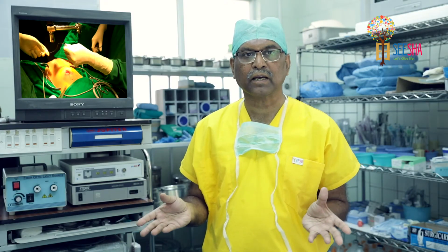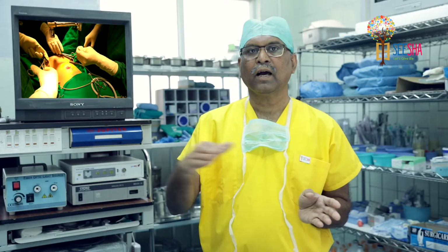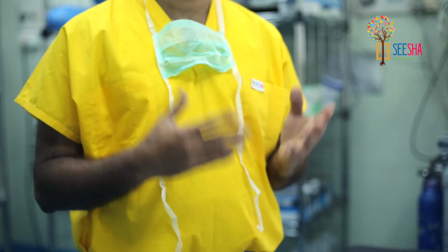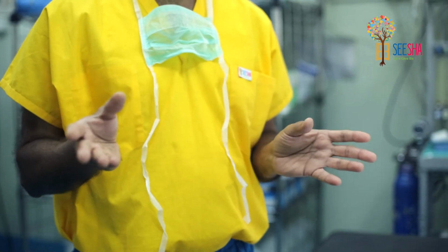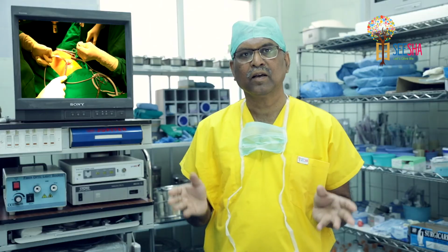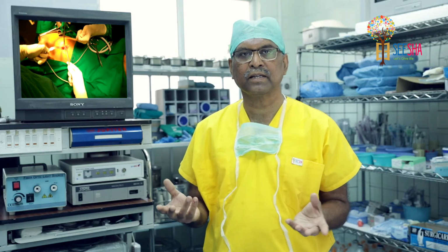And before closing, it is good to inspect the entire abdominal cavity, look for injuries or any other pathologies which might be there. And recently what we have been doing is we are comparing leaving the methylene blue or saline solution that we use for chromotubation, because we found that gives less post-operative adhesions and the chance of conceiving is more.